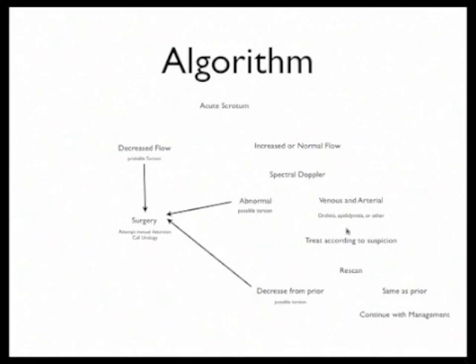The reason I say this is something that we haven't talked about. There are reports of this intermittent detorsion where you're going to have a patient, you've got the bell clapper deformity, so the thing can just twist around on itself as it wants to. And if you get really unlucky, a patient comes in with a torsion, and right before you scan them, they detorse, and then you look, and there's actually increased blood flow.